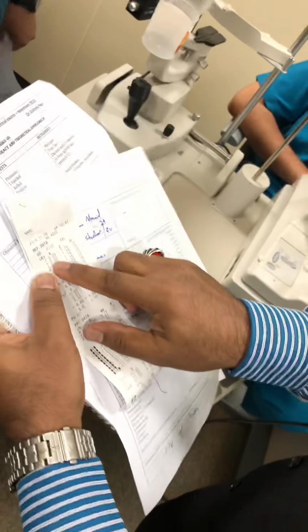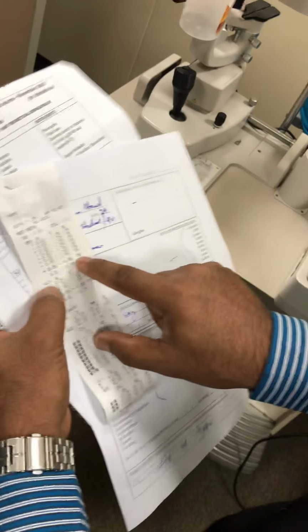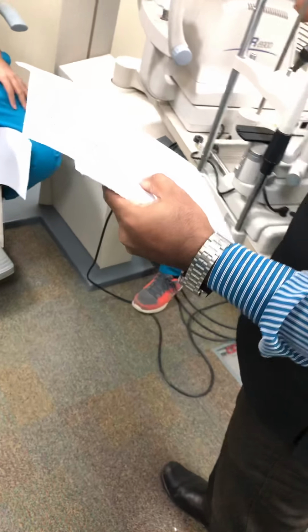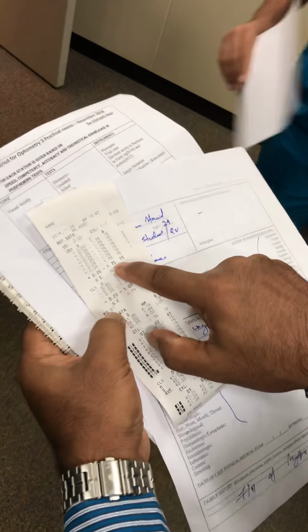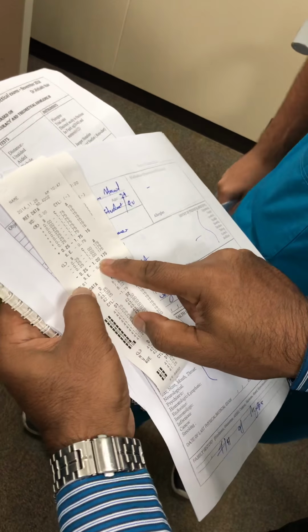So he has 1.75 astigmatism. See, the average is 0.25, 1.75, at 15 degrees. Right eye. Do you have an astigmatism in the right eye? Yes. You think? My visual acuity is not bad, 6 by 6. See why you are not wearing glasses now. So see, the average is right eye 1.75 here. Left eye is 1 cylinder here.